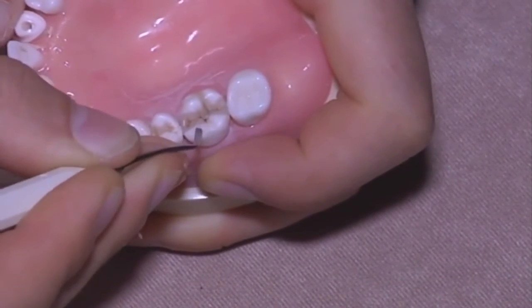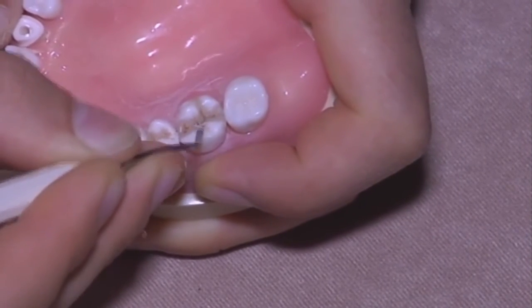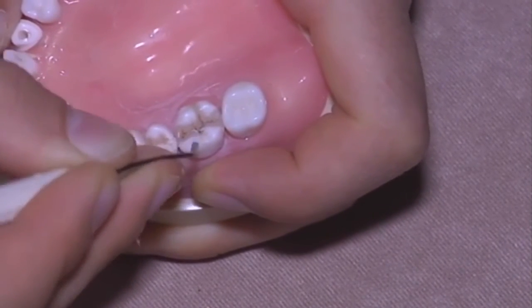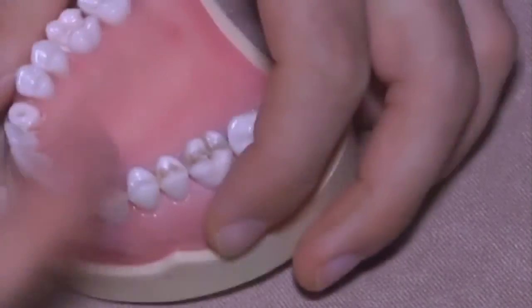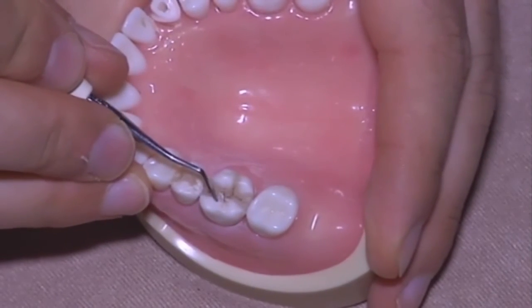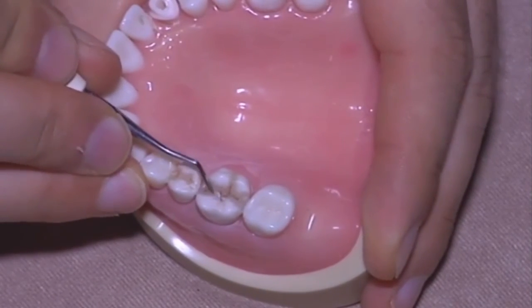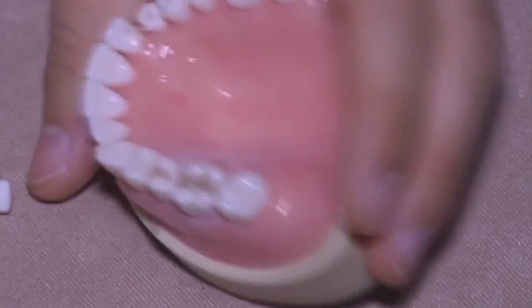And in reality I used to remove this amount of composite, which happens to be out on the occlusal surface, with a red ring bur, as I told you.